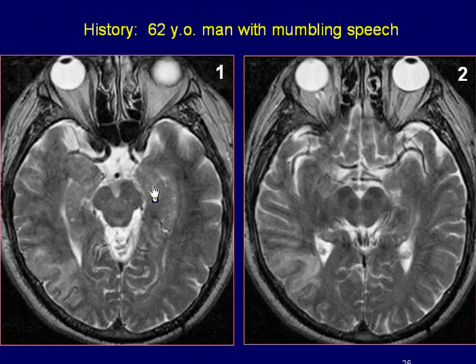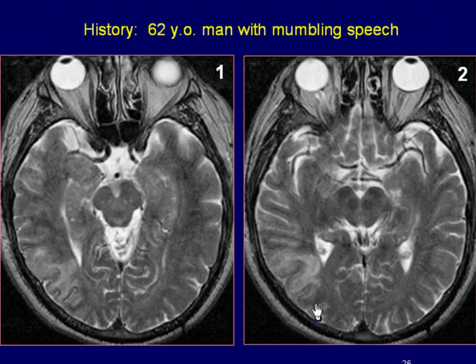A 62-year-old man with dysarthria. Axial T2-weighted image of the brain reveals a hyper-intense lesion involving both grey and white matter in the right posterior temporal region.